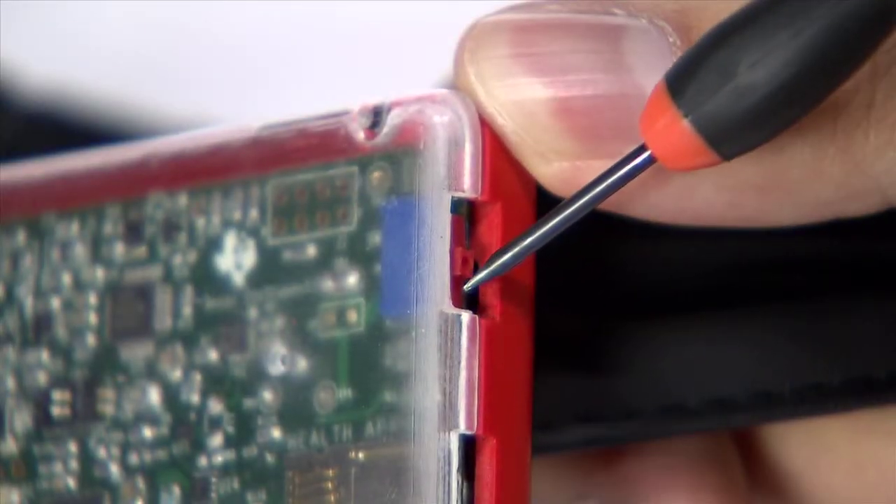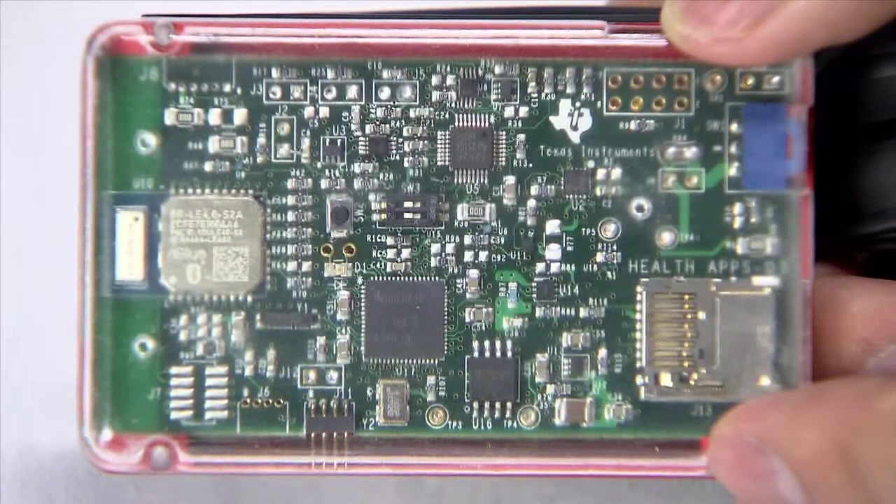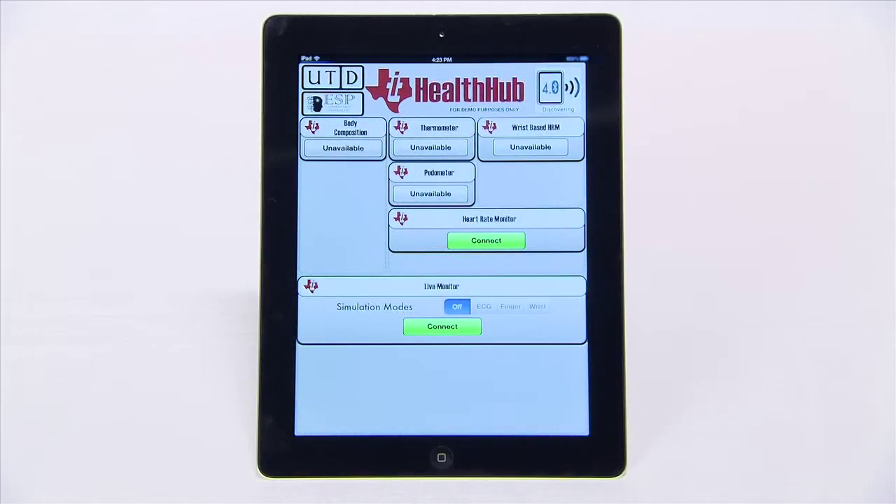Use the on-off switch on the device to turn it on. A yellow LED will start blinking indicating the board is on and ready for pairing. Hit the find devices button on the application. The connect button will appear in the live monitor tile and the heart rate monitor tile.